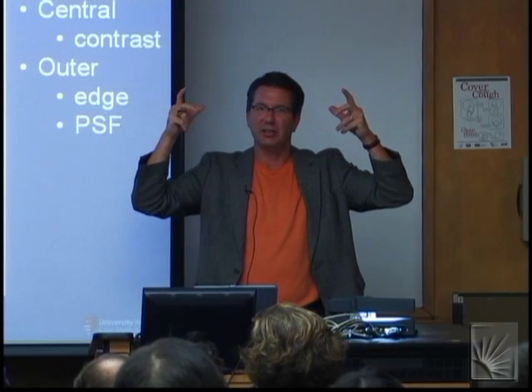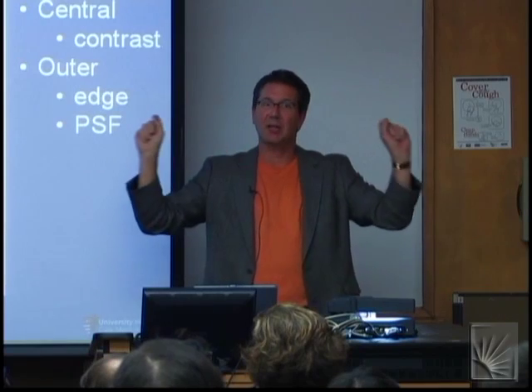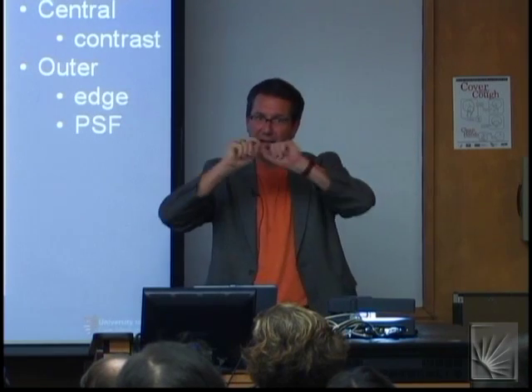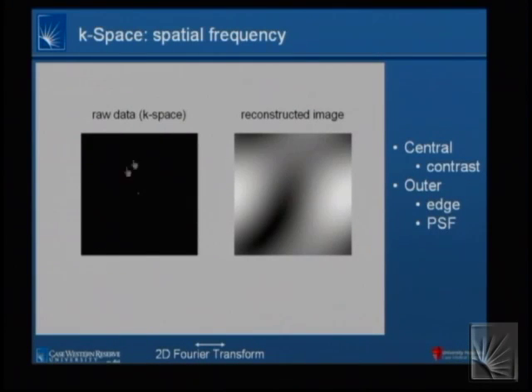So by analogy, when I talk about this Fourier transform space, because this is telling me how I'm collecting my signal, I collect my signal in the Fourier transform space. This is the center of K-space. It's sort of the center of the spectrum. It tells me what's the average value in my image of Dr. Leparo, okay? And so I've taken this one point, actually it's a couple points, and I've reconstructed it. And I think you'd all say, you know, there's not much detail there, but I sort of give some information about the average value in that image, okay?